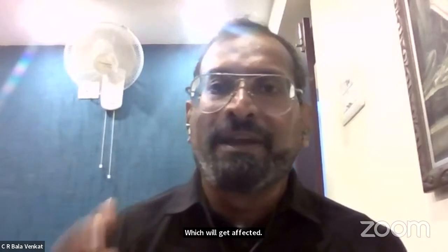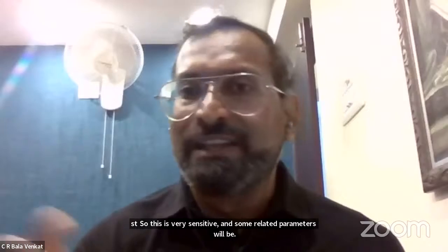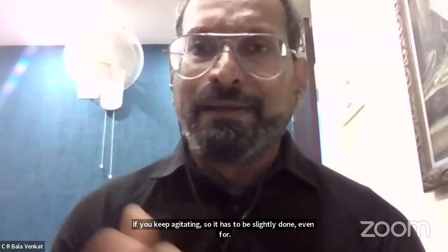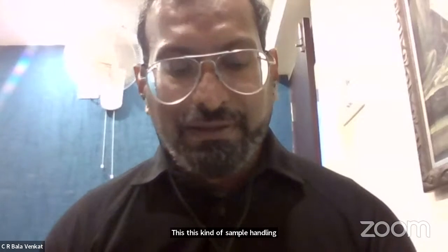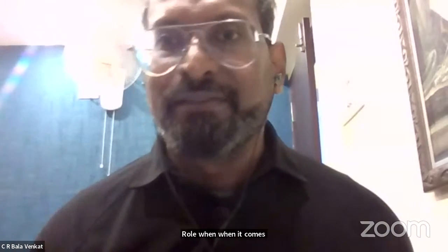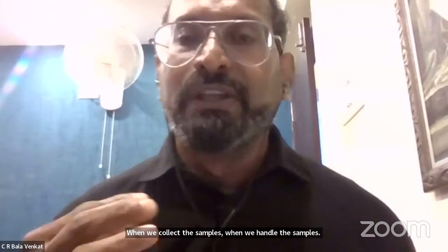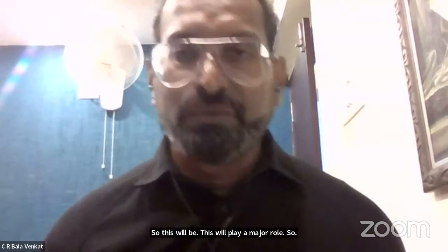So enzyme related parameters will be broken if you keep agitating. So it has to be done slightly gently. Even for control hematology, we have to be very cautious. This kind of sample handling plays the major role when it comes to pre-analytical errors. When we collect the sample and when we handle the samples, this will play a major role. So the same kind of handling should be there for controls and calibrators. That is more important.